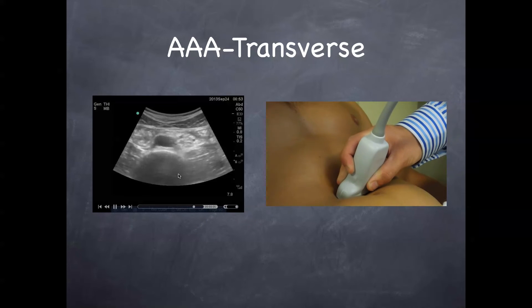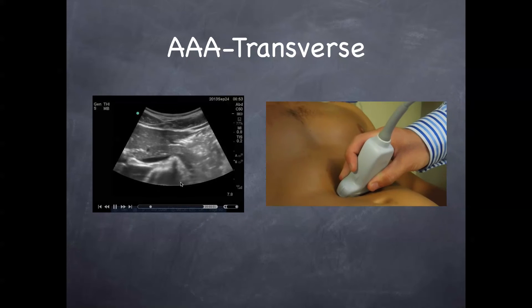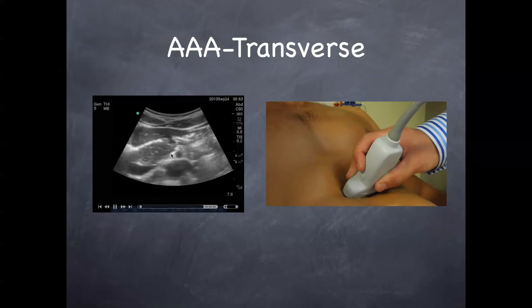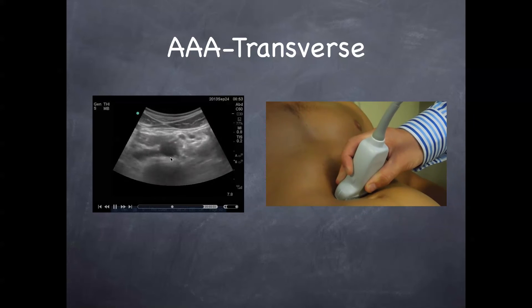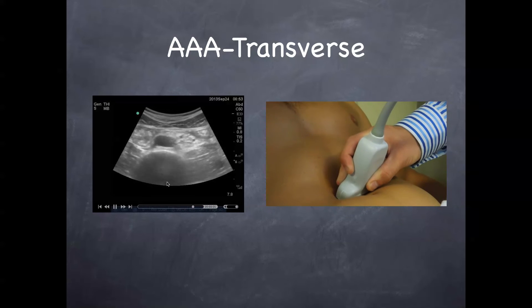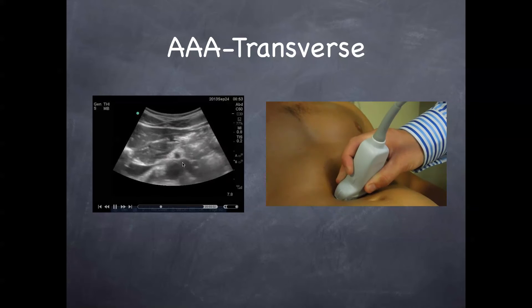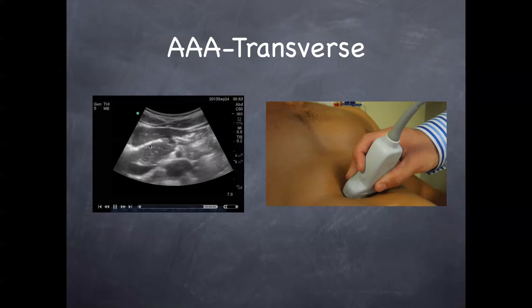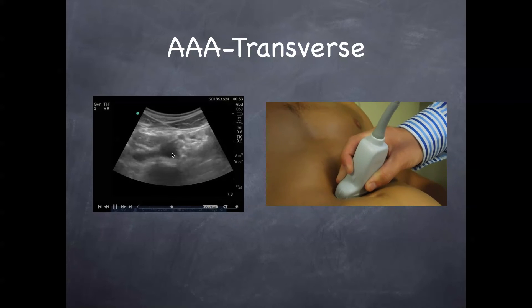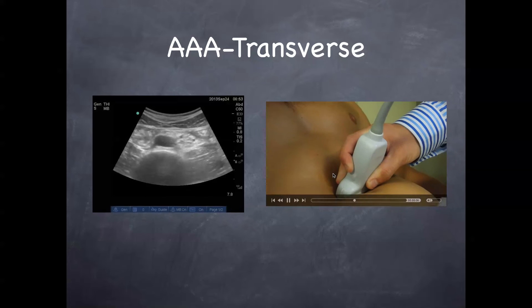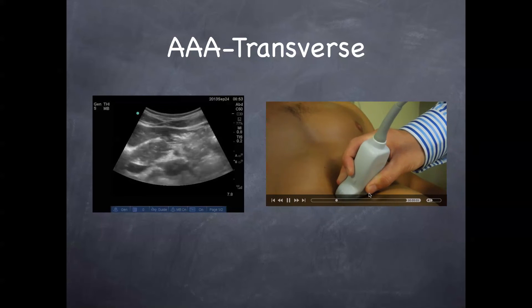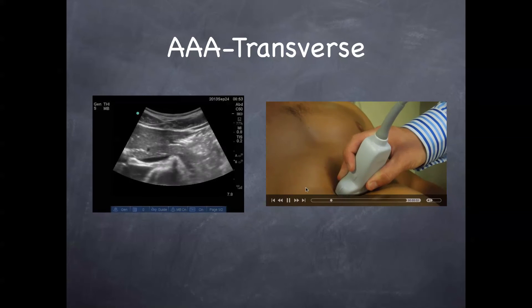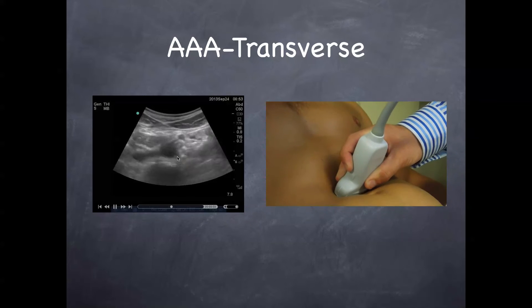In the transverse view, the landmark you need to find every time is your vertebral body. It's a hyperechoic line with significant shadow behind it because it's a bone. Here's your aorta right in front. Here's your IVC, which kind of looks like a teardrop — it's going to be on the right of the patient. The aorta is going to be on the left of that, coming all the way down the body right to the belly button where it splits off.